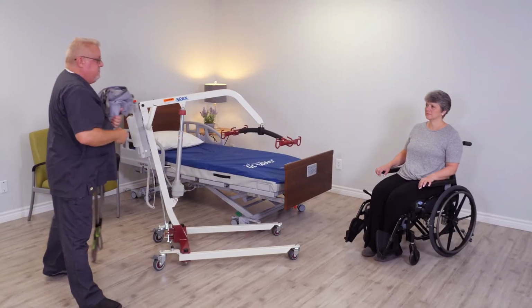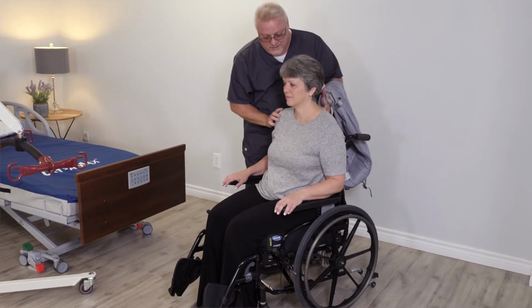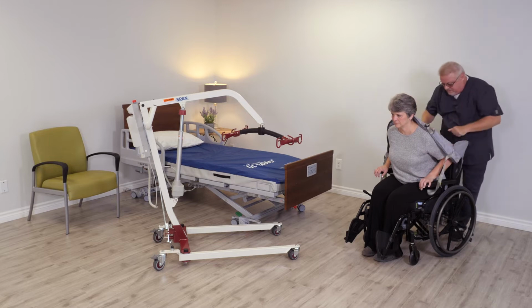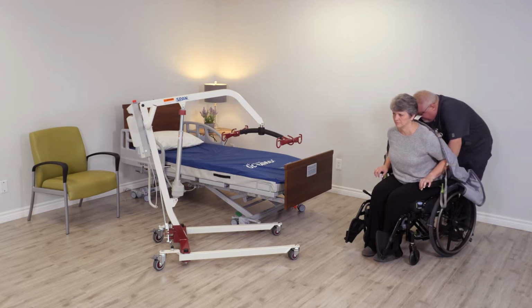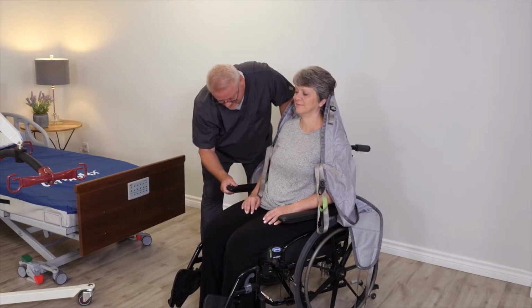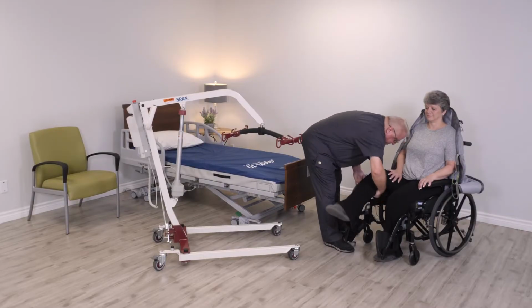For a chair-to-bed transfer, first we apply the sling. Lean the patient forward in the chair, getting help from another caregiver if need be. Push the sling down to the base of the seat back. Lean the patient back against the seat back. Lift the armrests, if possible, and pull the leg straps around the thighs.